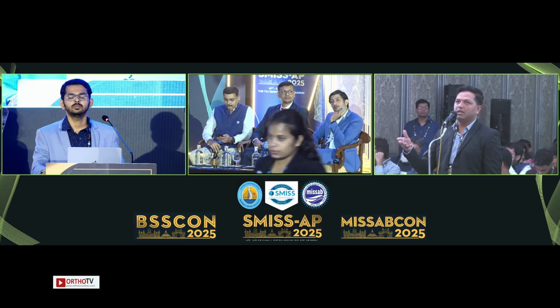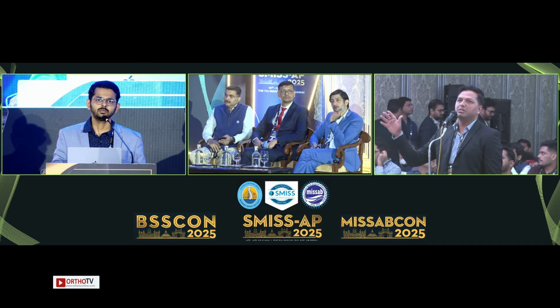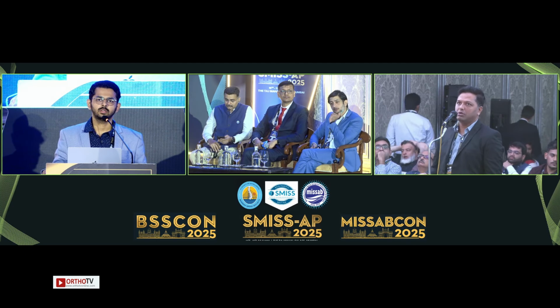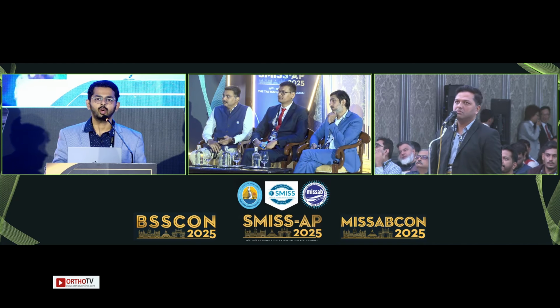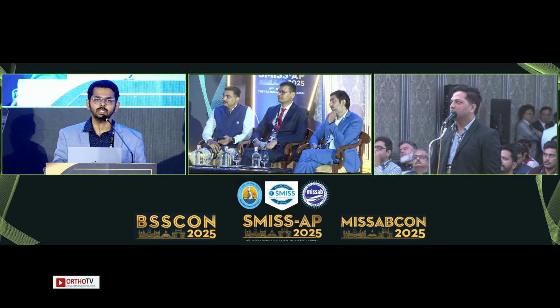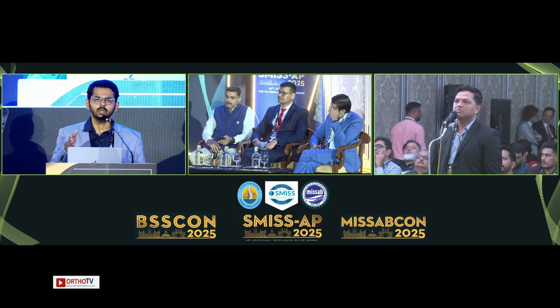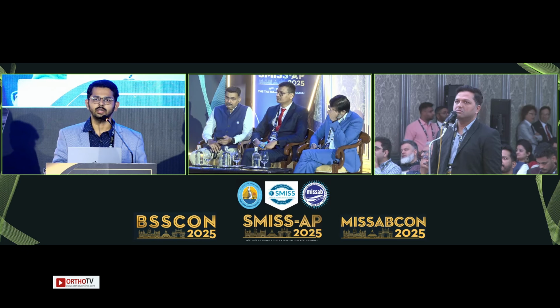The facet will be the bony part you are facing. But in the upper lumbar spine, the whole part will be the bone only. So how are you going to decide whether to drill the pars or go transforaminally? That is my question. In the upper lumbar also, our docking point is usually the 12 o'clock position of the pedicle-SAP junction. So we have to do the decompression through the foraminal route only. We land at the 12 o'clock position of the pedicle, we burr the SAP and go cranially or caudally, depending on the pathology that we want to deal with.